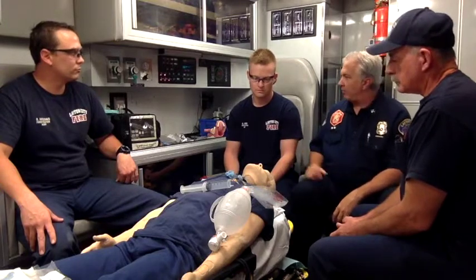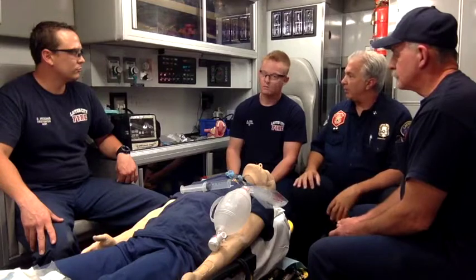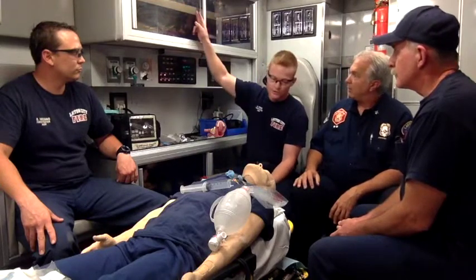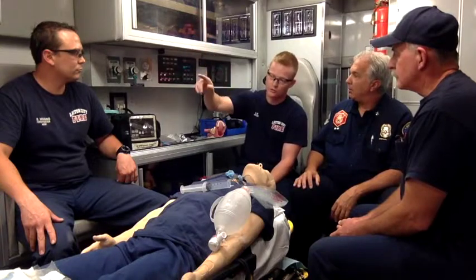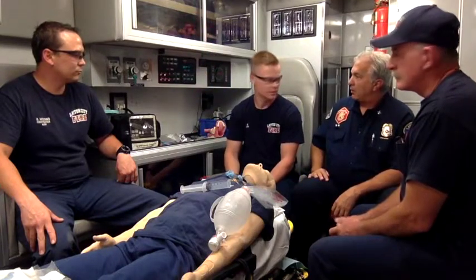So where are these, by the way? I had to scavenge all over. Where are these in our rigs and in our bags? Up on top of the shelf with our airway, our non-rebreathers, our cannulas. Also, some of the oxygen bags have them with the OPAs and the NPAs.